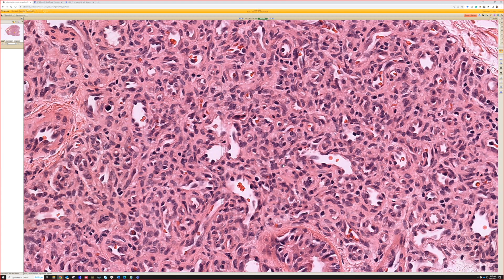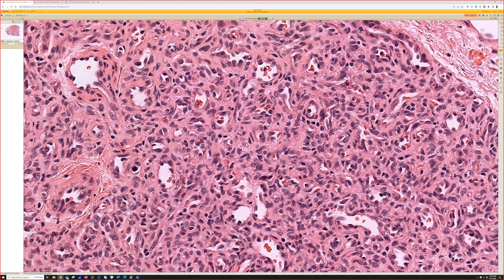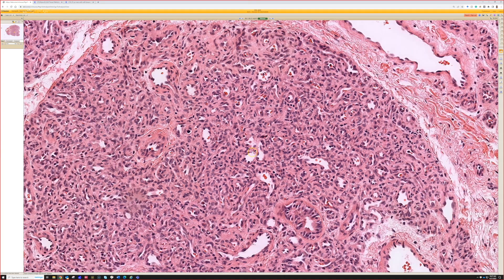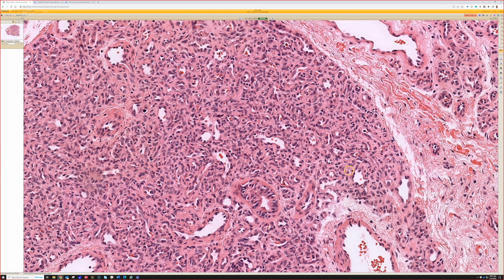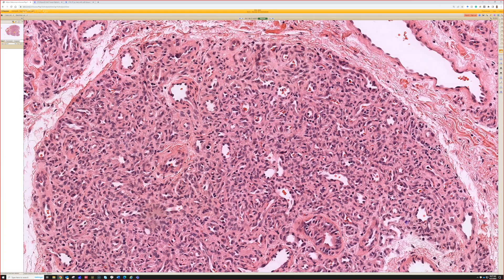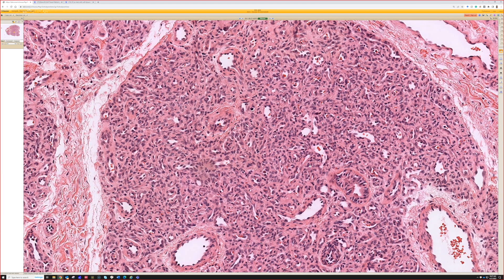If we did a CD31 marker, we would see there are actually tons of super tiny channels — barely big enough for a red cell to squeeze through. There are also some spindle cells. If you do a CD31 with a smooth muscle actin, the actin will label many of the cellular background elements — those are pericytes, the modified smooth muscle cells that wrap around all the little vessels. So sometimes if you have a cellular process and you're trying to visualize what's going on, doing a CD31 or ERG plus an actin can help you see that there's actually a lot more organization and structure.